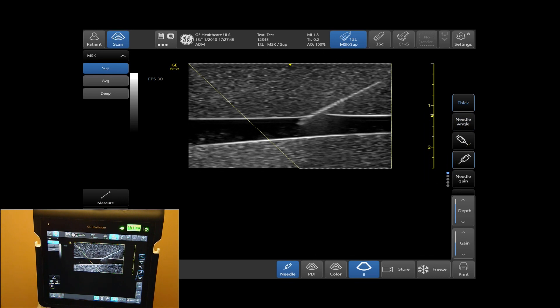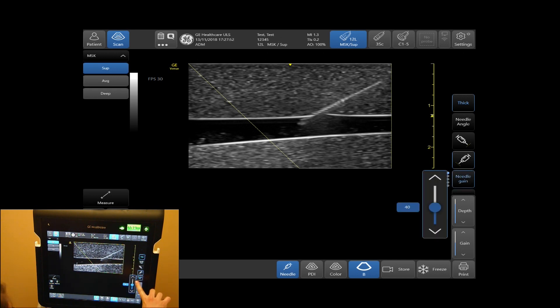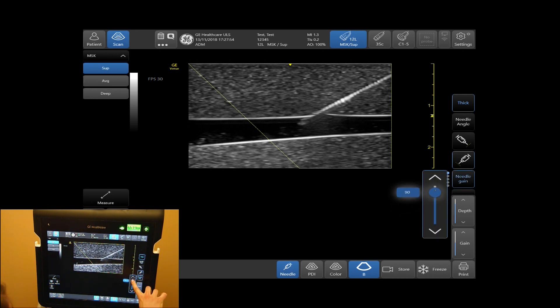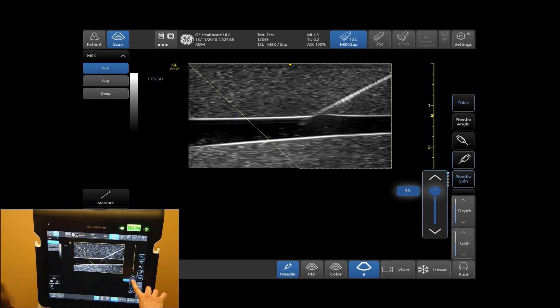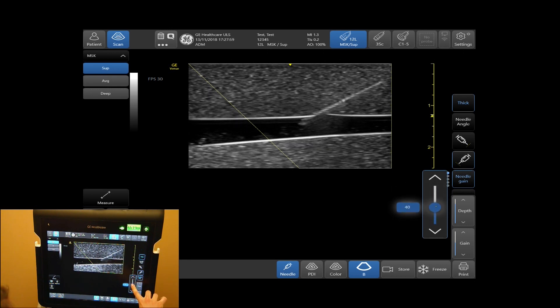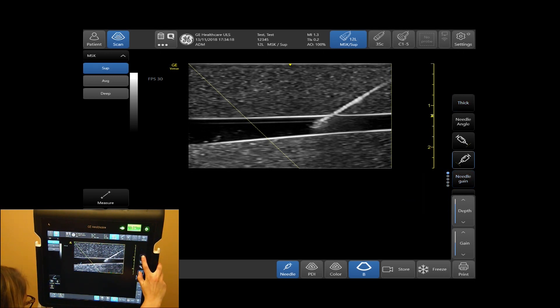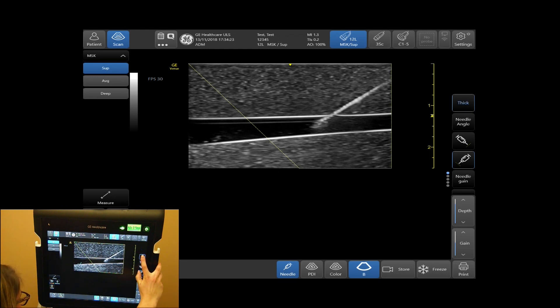You can also adjust the brightness of your needle reflection by adjusting needle gain — here you can increase and decrease your gain. By selecting your thick tab, you will toggle between a thinner or thicker appearing needle reflection.